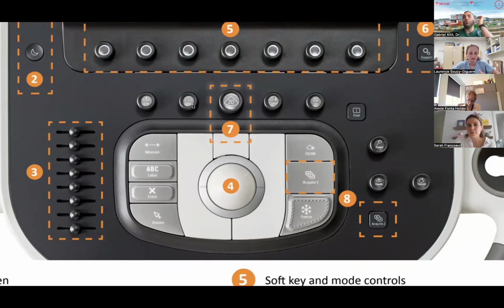Pulse wave Doppler is something you're going to want to use to capture the speed in a very discrete area of your anatomy. So I'm interested in looking at the speed of an artery. Or I'm doing an art line, like for you, Sarah, you're doing POCUS, you're doing an art line. You want to make sure you're in the artery and you're not in the vein. So you want to see the pulsation.